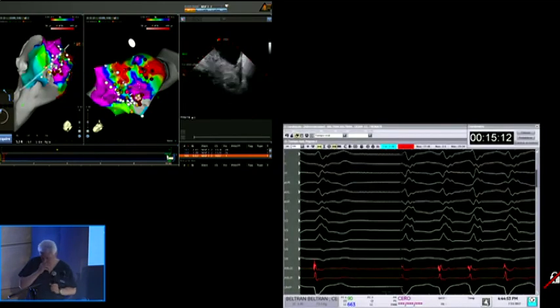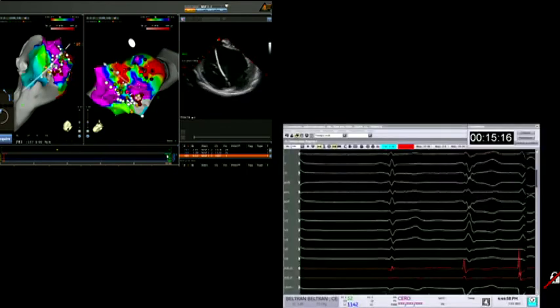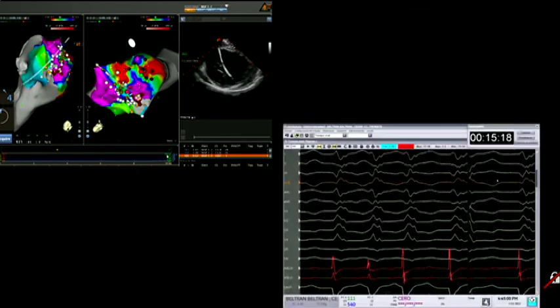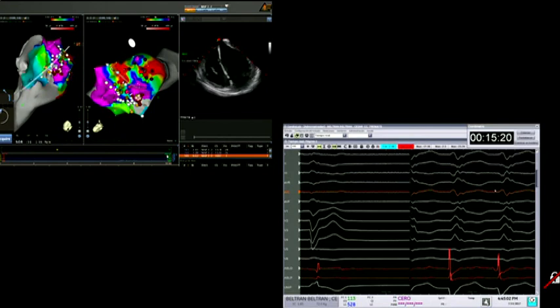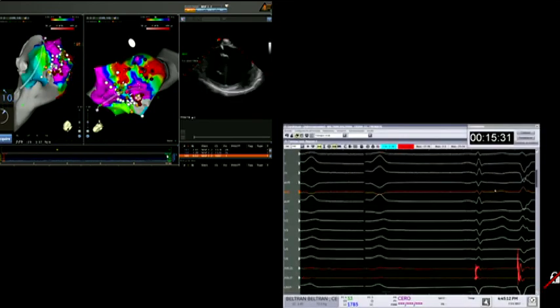Yes. We have it ready? Okay. Yep. Well, while we finish choosing the voltage points, can you show us the camera to show the pentarray? We want the Panarex camera. So start washing.